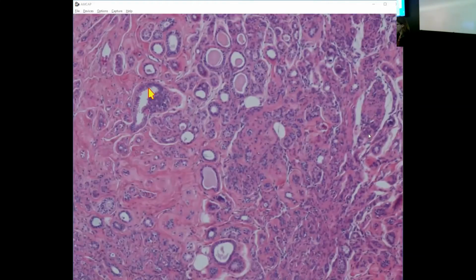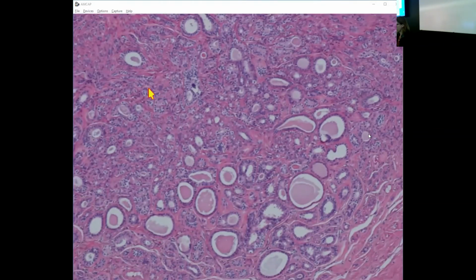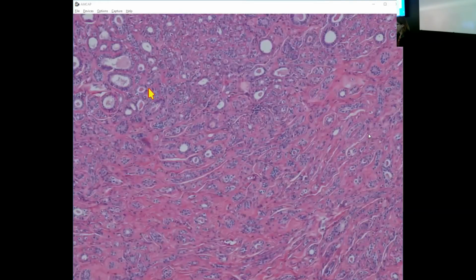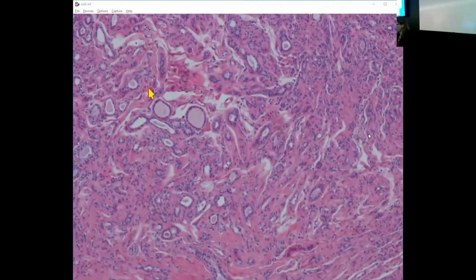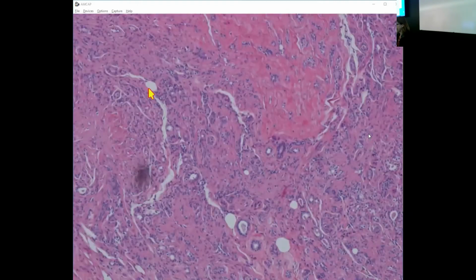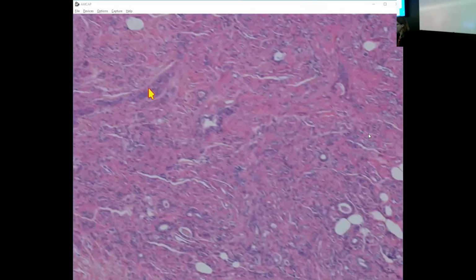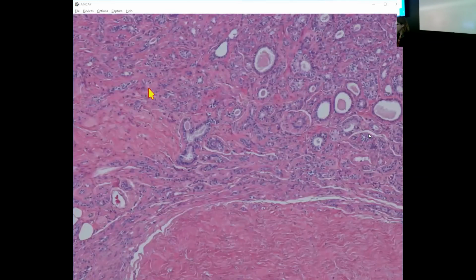But again, it's just lots of little glands coalescing together, and you'll have the myoepithelial cells as well. Sometimes I feel like in benign adenosis, the nuclei look round and monomorphic. So if there's no proliferation, then I leave it at adenosis, sclerosing adenosis.